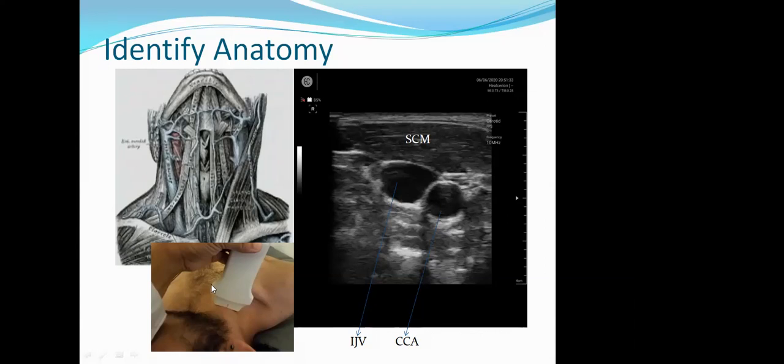So if you look at over here, the marker is here on the probe. And then on the screen, you will also see a marker, which different machines have different symbols for. I'm using a handheld probe, and the marker is here on this side. It is written as right. So the marker side on the screen and the marker on the probe should always be on the same side.